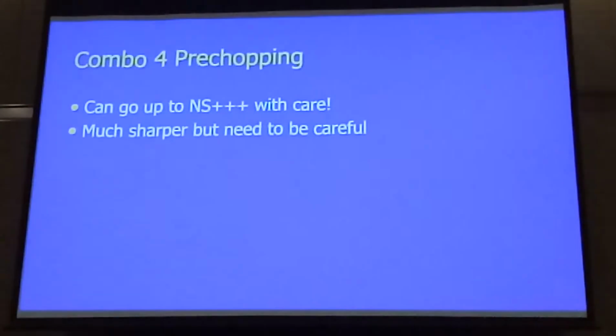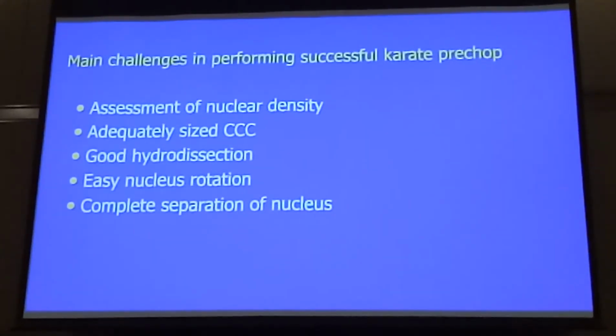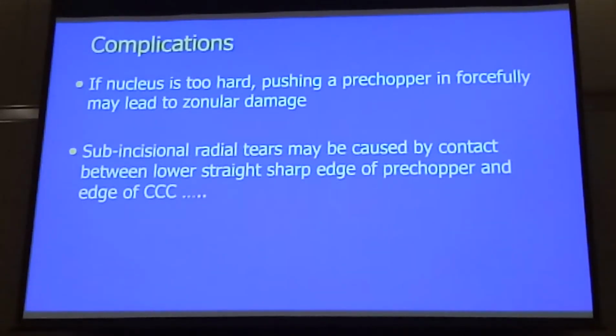So with a combo 4 pre-chopping, you can go up to 3+ nuclear sclerosis with care. It's much sharper, but because it's sharper, you also got to be more careful you don't touch the edge of the capsulorhexis. One of the main challenges in doing a successful pre-chop is assessment of the nuclear density. So in clinic, I will always write down 1+, 2+, or 3+, so I know myself in the OR which pre-chopper I'm going to use. Good size CCC, good hydrodissection, easy nucleus rotation, and again, complete separation of the nucleus.